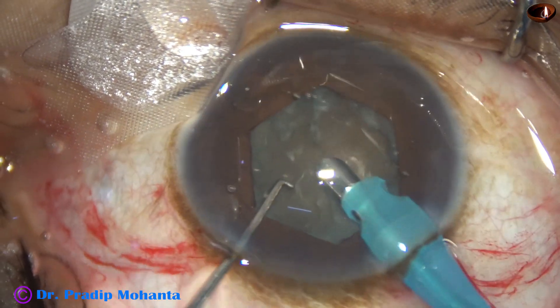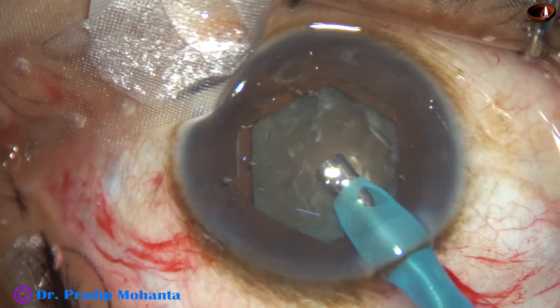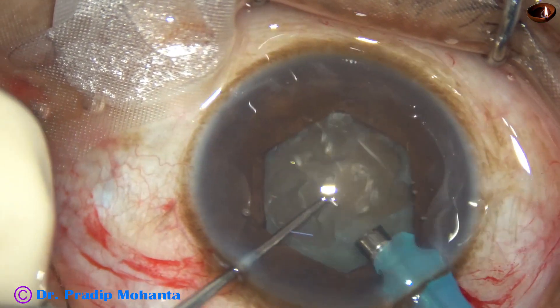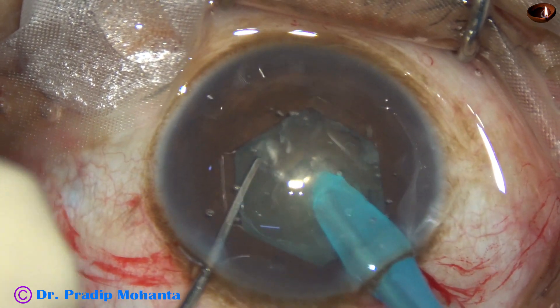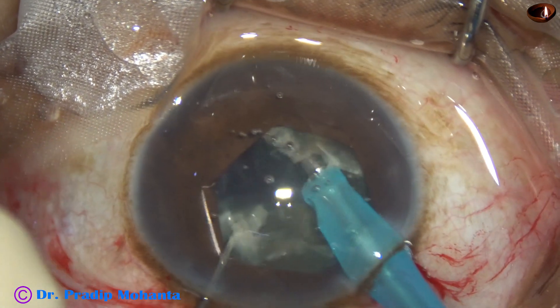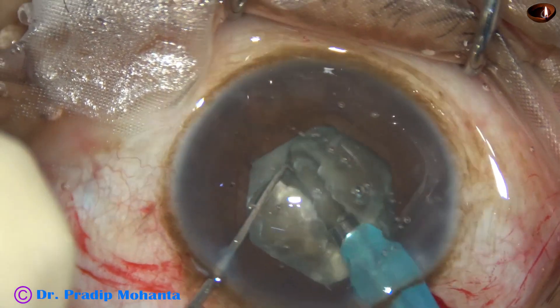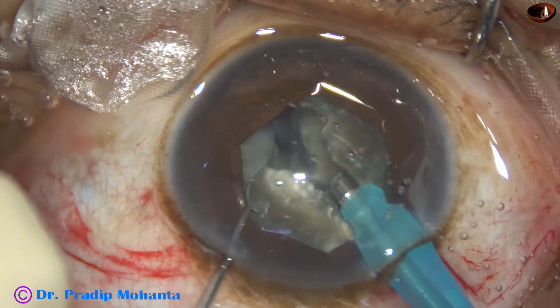Some superficial lens matter is removed. The handpiece is then turned to orient the bevel upward. Now watch the Submarine chop technique: the tip is buried into the substance of the nucleus and travels through the nucleus towards the opposite equator. The chopper is used to make a very good crack. The nucleus is rotated 180 degrees, the tip goes to a deeper plane, and the two hemi-nuclei are completely separated.